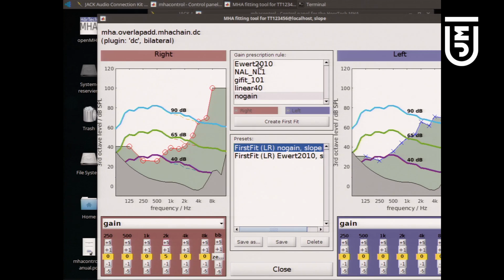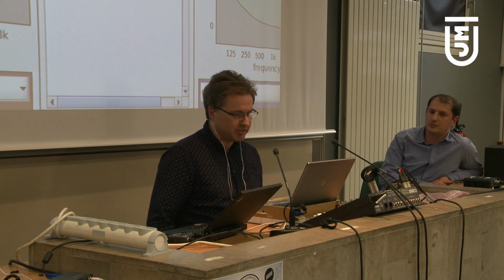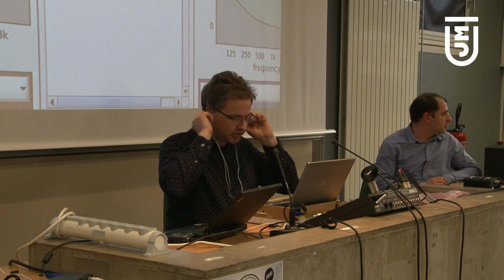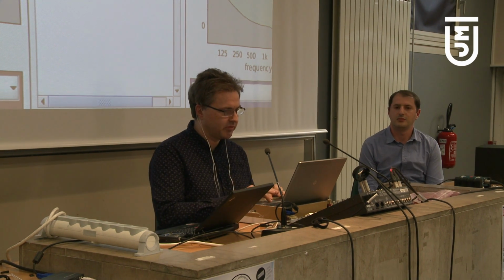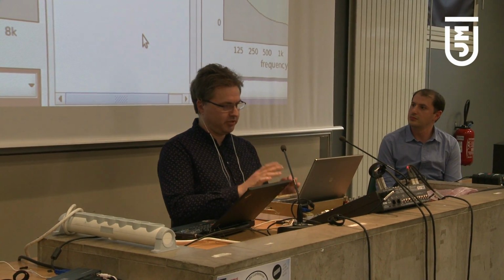And if I do this for a real fitting rule, I should first put the hearing aids in. As you can see, these are no longer real standalone hearing aids, but we attached cables to them. Actually, the hearing aid manufacturer did this for us, because hearing aids are really small and require certain skills to attach cables to them.